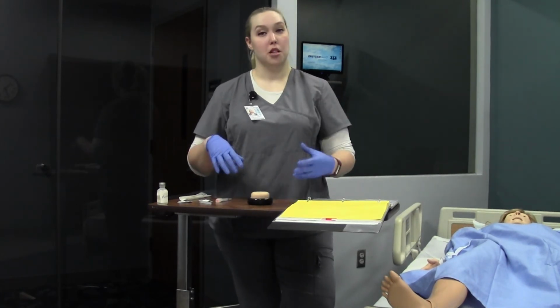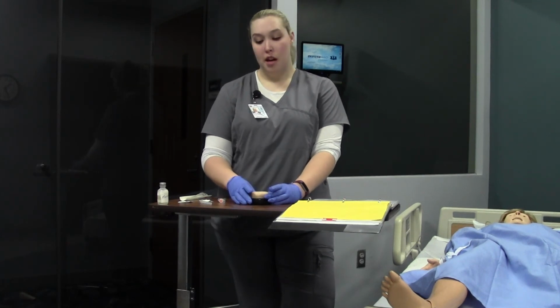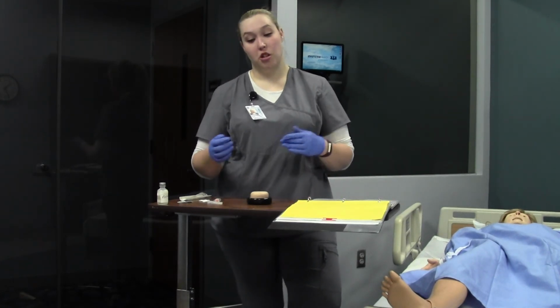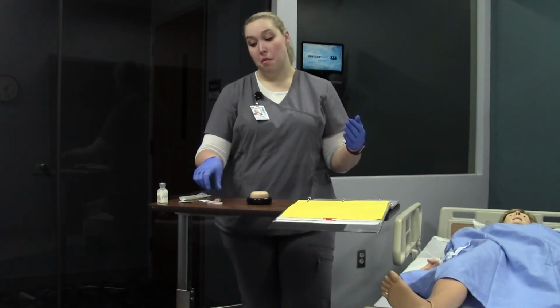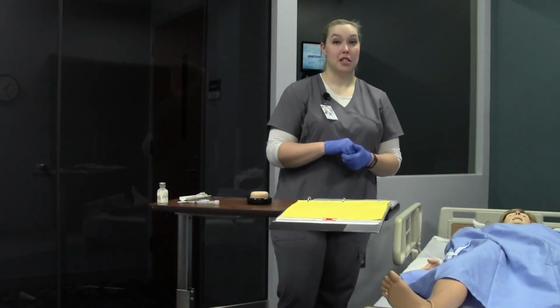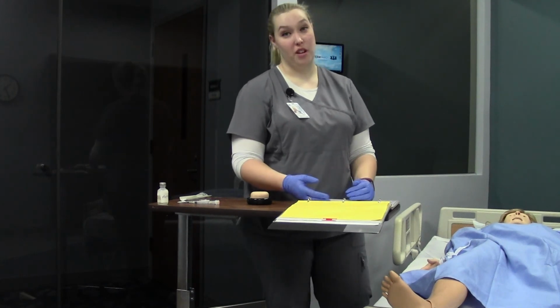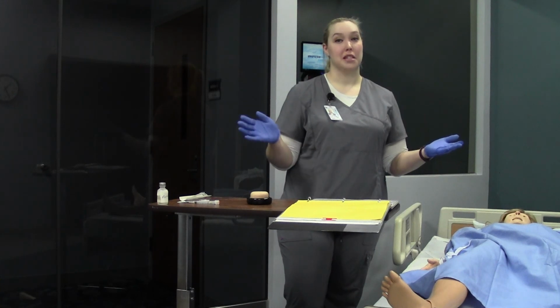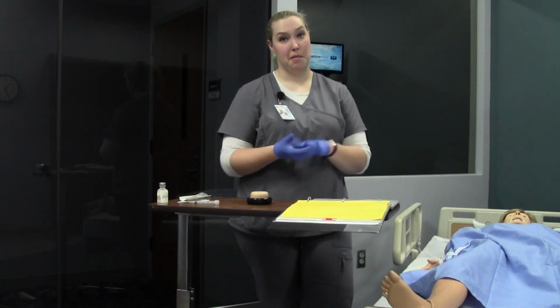If in fact you have a smaller patient, you may need to use a shorter needle just so we don't hit bone. But most commonly you're going to use the 1-inch needle. And then make sure that when you're done, you clean up your supplies, tuck your patient back in, thank them. Make sure you put everything that's needed in the sharps container. And then you need to come back in 30 minutes and make sure that your patient's pain has improved. If not, then we need to go back and look at the MAR and see what else we have available for their pain. Oral medication, you can do 45 minutes to 60 minutes, but since this is IM, you're going to do 30 minutes to 45 minutes to make sure that the pain medication has worked.